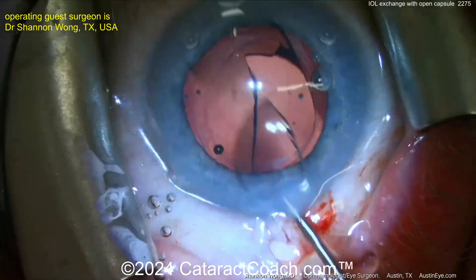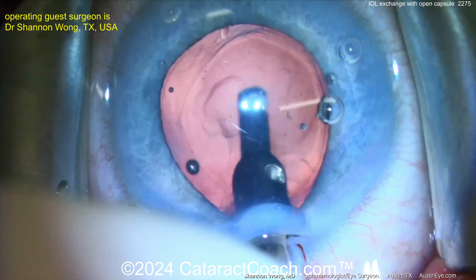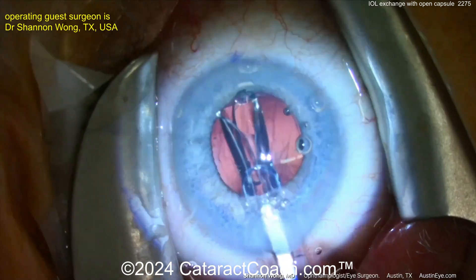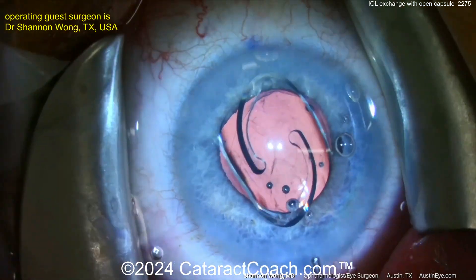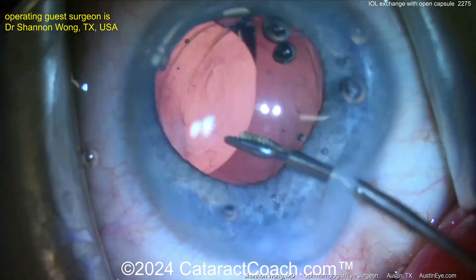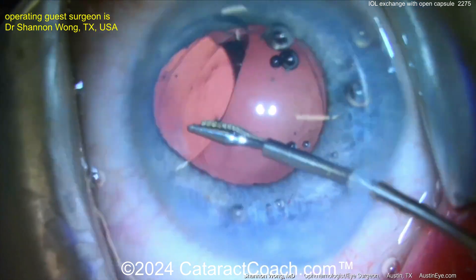Once you get the lens up, you can exchange it — cut it in half or use our twist-and-out technique. A little bit of anterior vitrectomy is needed here. Here's a coaxial setup, although I prefer bimanual. Now here's the new lens.